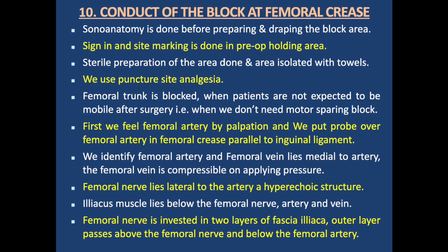Femoral trunk is blocked when the patients are not expected to be mobile after surgery. That is when we don't need a motor sparing block. If we need a motor sparing block, we have to come down to avoid the nerves which are given from the femoral nerve at femoral crease. We do subsartorial or adductor block for them when we need the patient to be mobile.